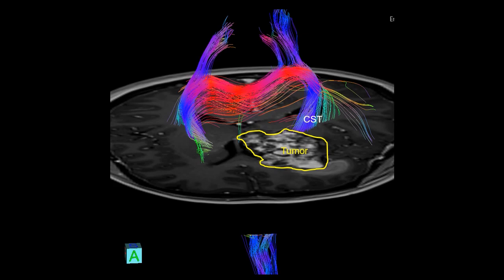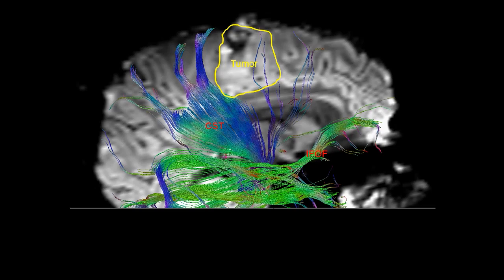Next, we'll move on to diffusion tensor imaging. Shown here is the corticospinal tract as determined by diffusion tensor imaging posterior to the tumor. The sagittal plane here, we see again the corticospinal tract posterior to the tumor, as well as the inferior frontal occipital fasciculus, the longest white matter tract in the human brain.